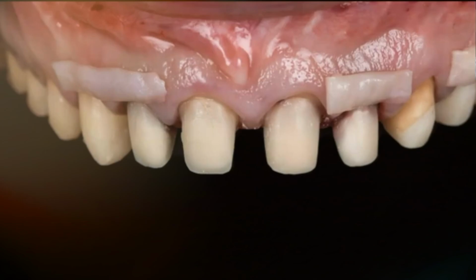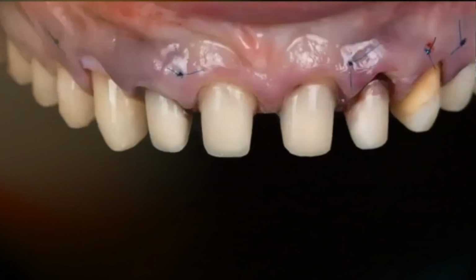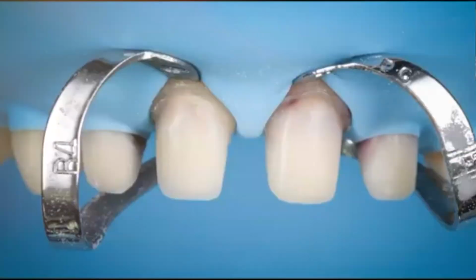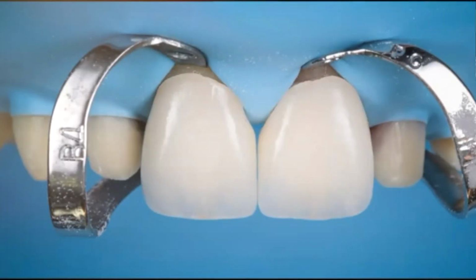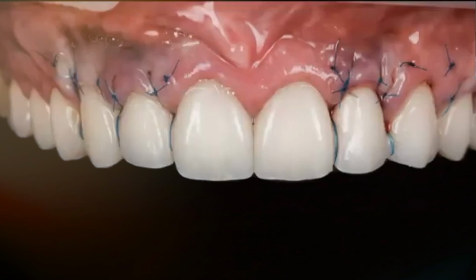Then they are going to take like the soft tissue grafts, and they are going to create the tunnel, the pouches, place the soft tissue grafts, and just place the stabilizing sutures of the grafts. Then the second they do this, I take the rubber dam, isolate everything. I can bond. I can clean the cement very well. And the last thing they do, they come and they put like a composite in the contact area and put the final sutures to bring the tissue down. So this is how we solve also the dark of the tissue.